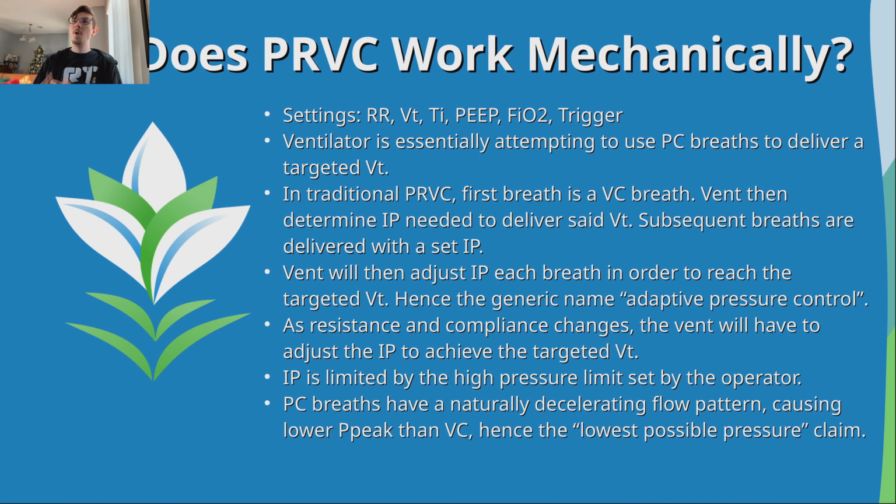Okay? So on a mechanical level, how does PRVC work? Well, let's look at the settings you can set. You can set your respiratory rate, your tidal volume, your I time, your PEEP, your FiO2, and your trigger variable. So it basically looks like volume control. It looks like volume control on the servo, where you set I time instead of flow. But it basically looks like volume control, right? Well, how does it actually work?